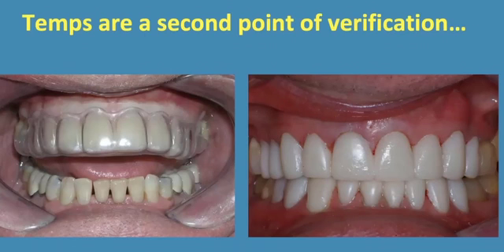There's also very little cleanup in this, usually just a little bit of film up at the gingival areas that needs to be cleaned up. The hard shell comes off first, and then you tease off that soft liner. If it were all one piece, you would never be able to remove that matrix, but having a hard and soft that separate allows you to utilize it. So it's very accurate. I saw a patient yesterday in my laboratory, and it was just amazing. It's life-changing.